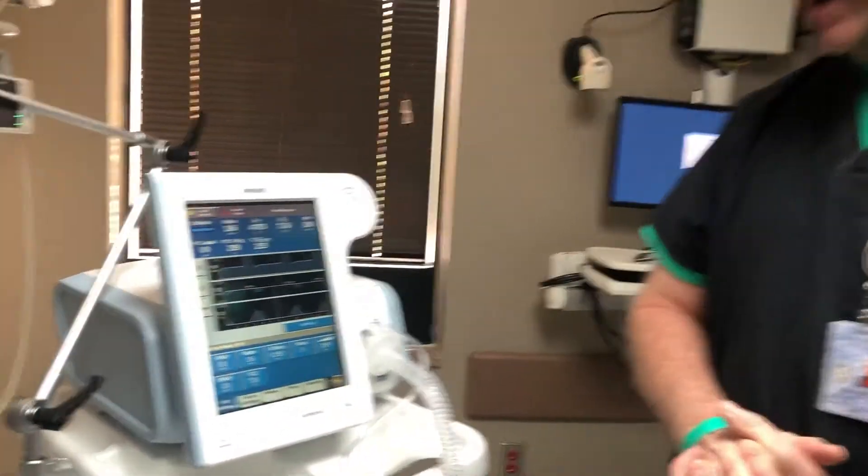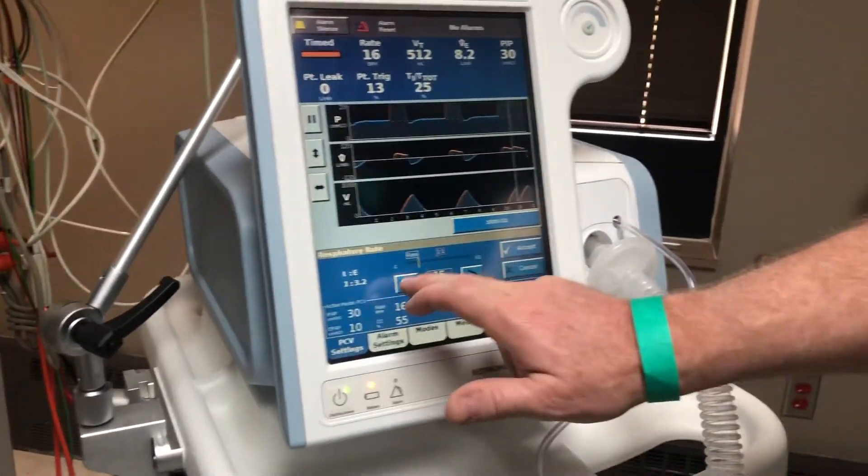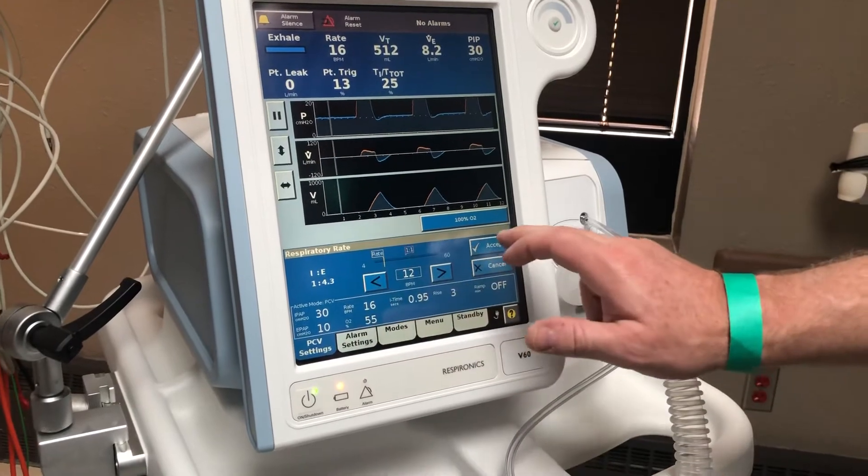Here's your respiratory rate. We've got a rate of 16 right now, but if you need a 12, all you do is touch it, change it down to 12, and hit accept.